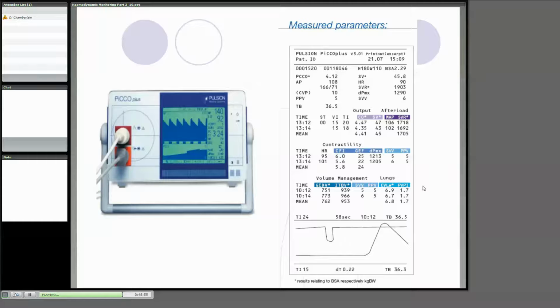They look at different compartments and give you an idea of what's happening in different compartments, because the one trick to blood flow is that it does have its compartments, and we guess a lot of the time. So cardiac function index and cardiac index the same? No, cardiac function index is a logarithmic calculation of what your contractility is. And there's no CI in that one? No, because that's about contractility. Cardiac index is about your cardiac output in its volume rather than as a measure of strength. Okay, so this is more of a measure of strength of your contractility.